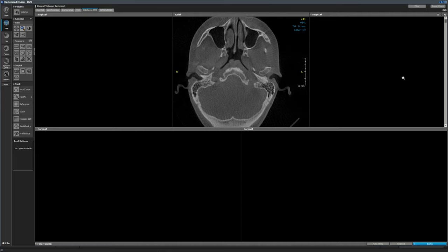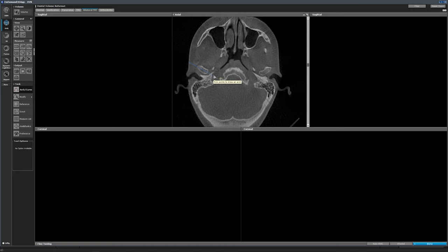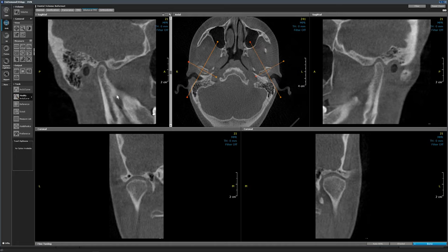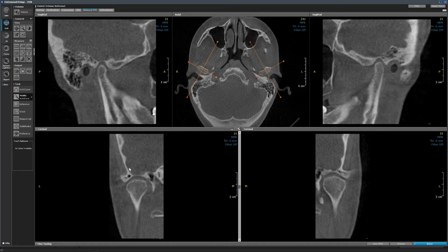After evaluating the dentition and the sinuses, we are going to evaluate the temporomandibular joints. From the axial view at the level of the condyles, we will create custom slices through the long axis of the condylar heads. We will ensure that these slices are through the long axis of the condyles. The resultant images are called corrected sagittal or modified sagittal and corrected coronal or modified coronal images.